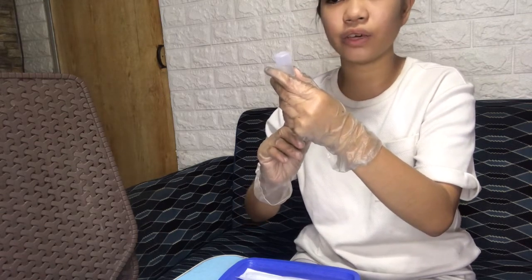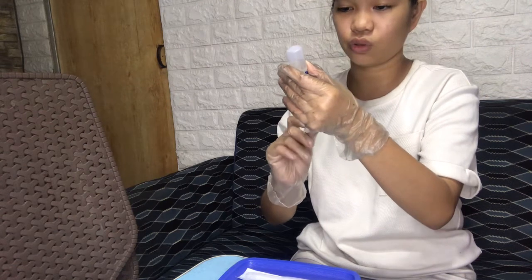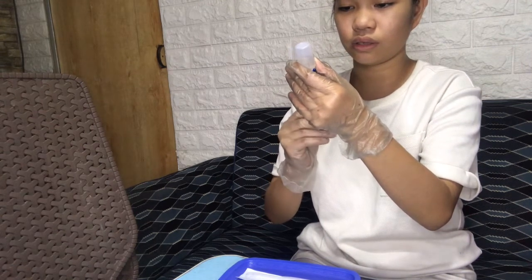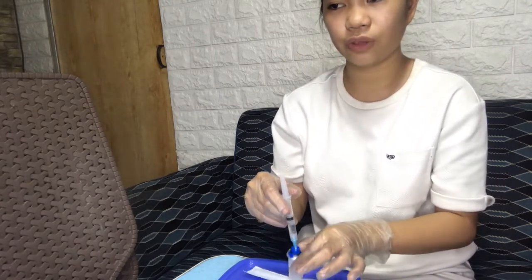After we inject the air into the vial, withdraw the prescribed amount of medication using either of the following methods. Hold the vial down with the base lower than the top, move the needle tip so that it is below the fluid level, and withdraw the medication. Or invert the vial to ensure the needle tip is below the fluid level, and gradually withdraw the medication.